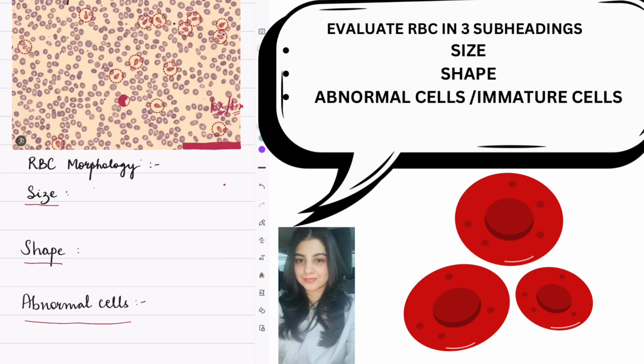Now you have to see whether the RBC is equal to, lesser, or more in size than the small lymphocyte. So always compare to small lymphocyte. Now if it is less in size than the lymphocyte, automatically it becomes microcytic.